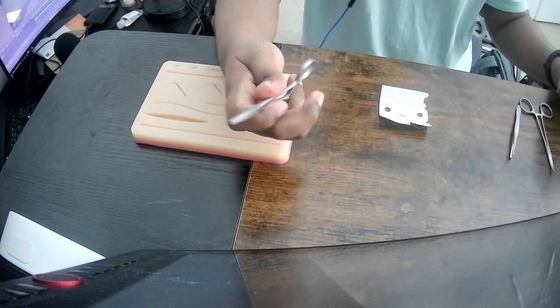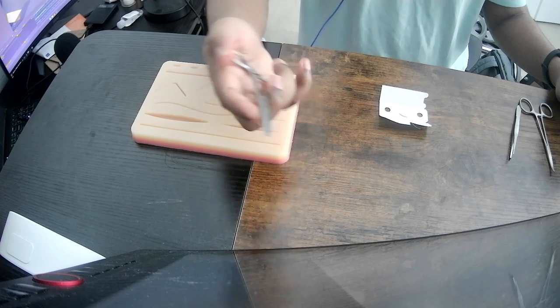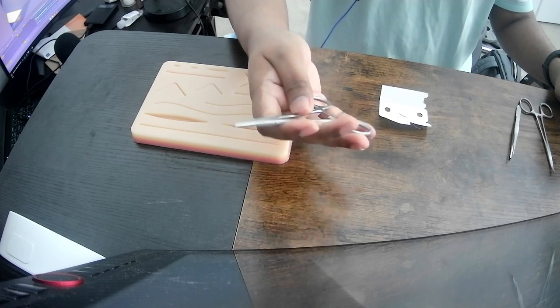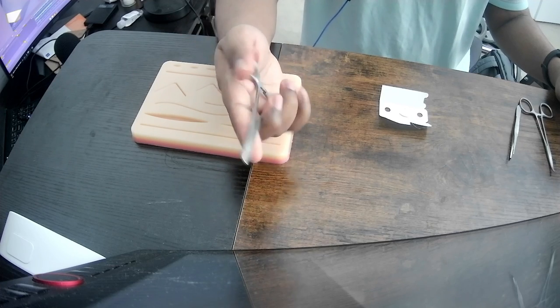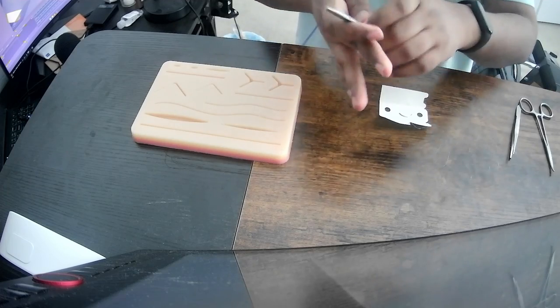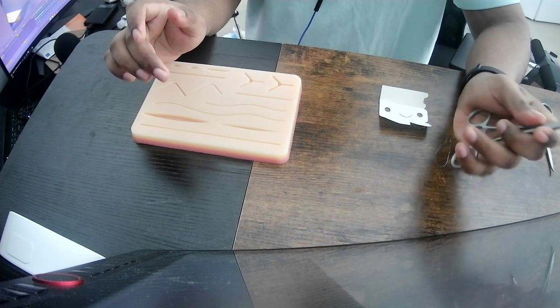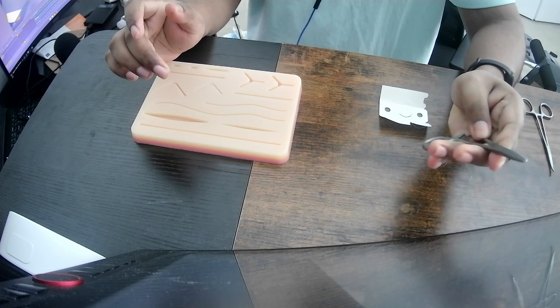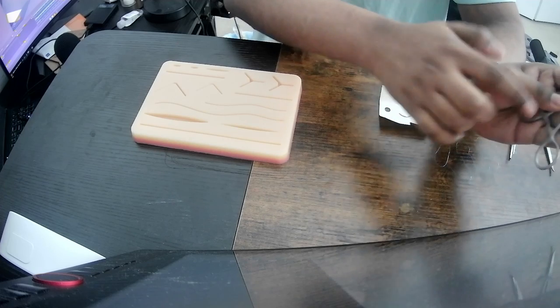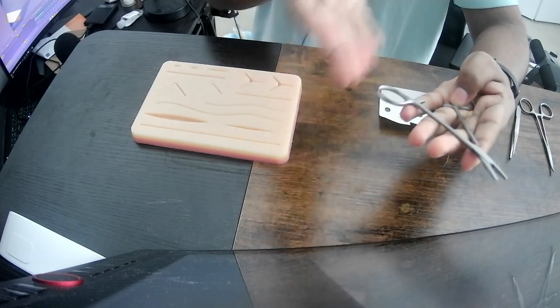The principle is the same on the other hand. I just need to get a better handle of it. And I think the correct orientation to palm the needle driver is like this. It's very stable. Rather than putting your fingers through the hoops, which is apparently the wrong way of doing it. Let's see. Okay. Oh yeah, I guess I did it inadvertently. How did I do that? Okay. So it seems like I'm still pushing and pulling. I'm holding this side with my left hand. I'm holding this firmly and pushing it with these fingers, pushing this up.